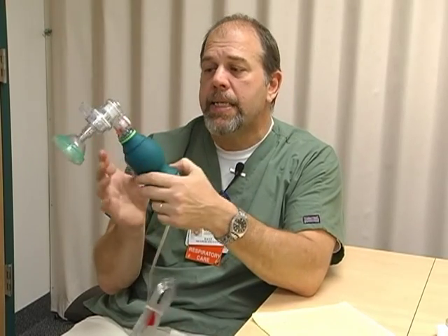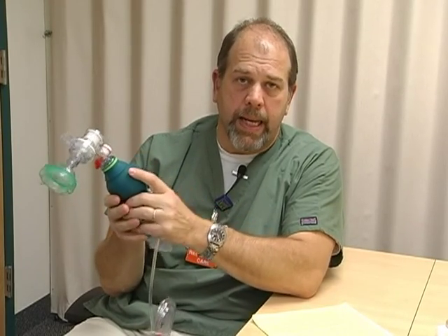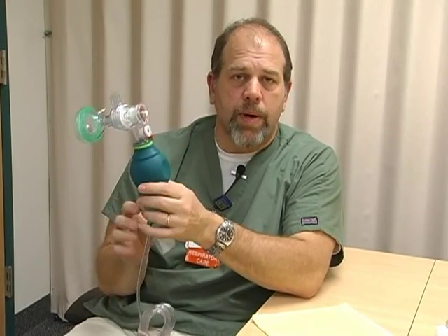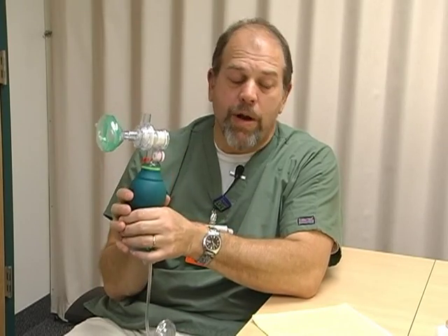You're going to be seeing this bag in the NICU, in labor and delivery, and in both the PEDS ED and the main ED. For ED nurses watching right now, you don't have to watch the rest of this video because we're going to go to a new device that we'll be strictly using in labor and delivery and the NICU. You can stop here or continue watching just for informational purposes.